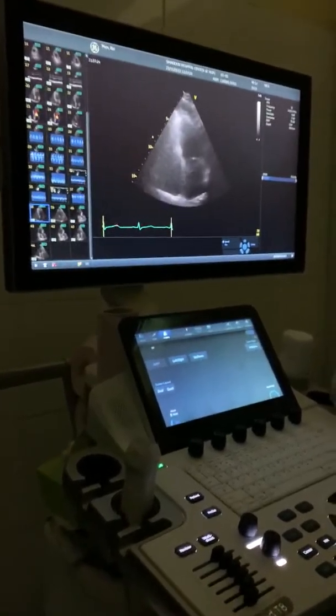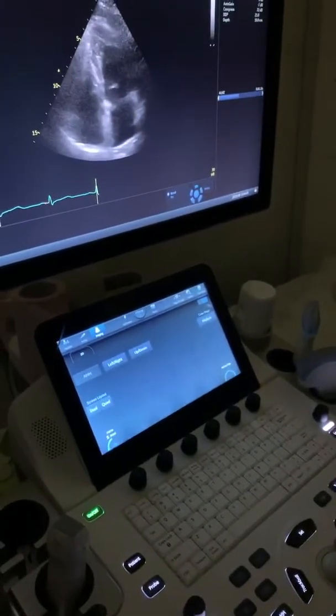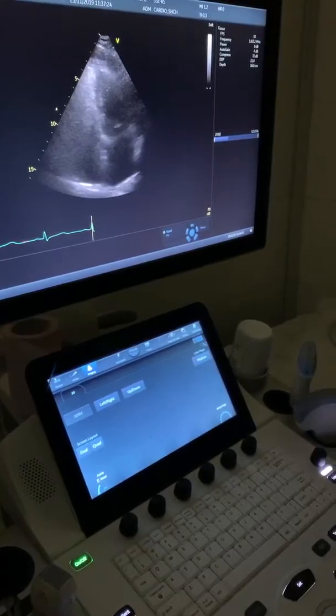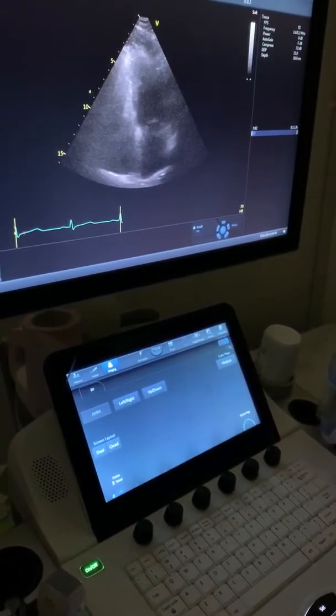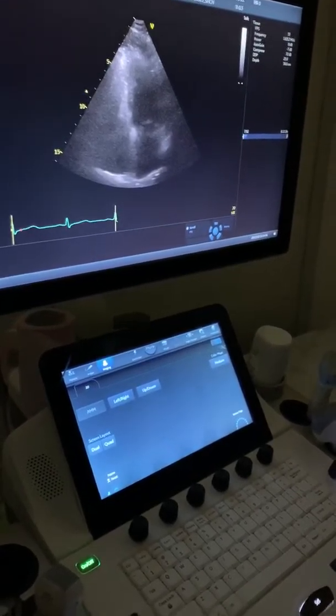Okay, you use your trackball in order for you to see. Okay, that's open. Yes. Okay, start a bit close. Not too much. Okay, this one is going down already. So you go like before it opens. Okay.